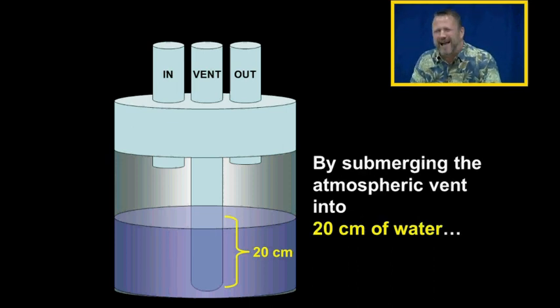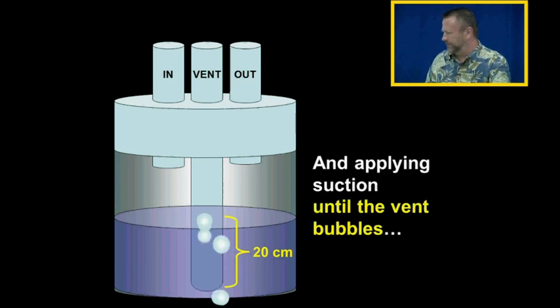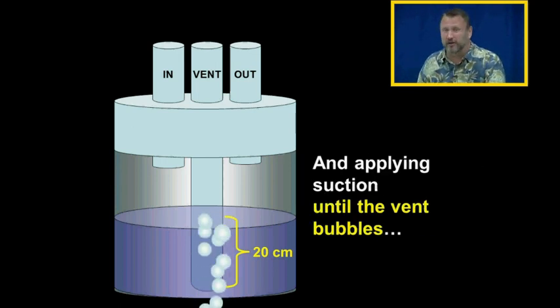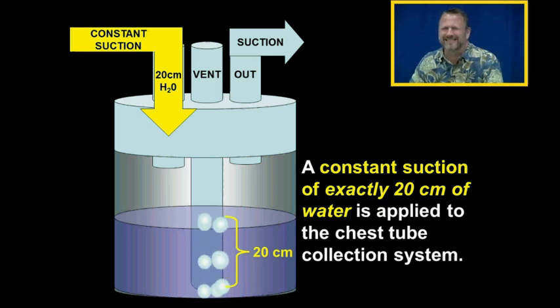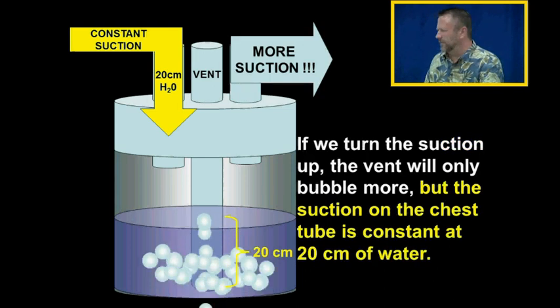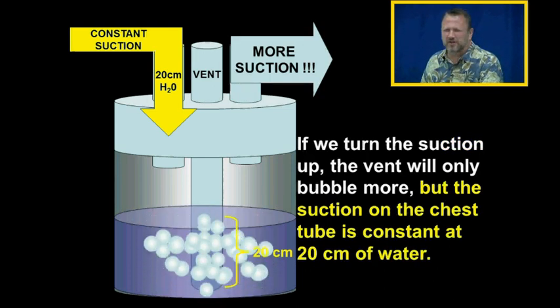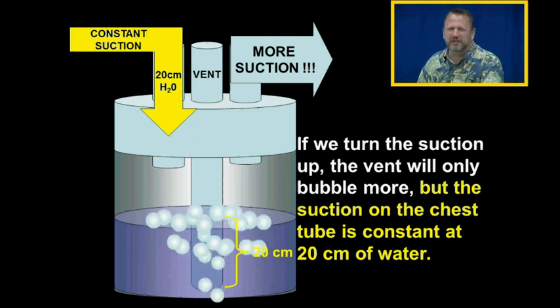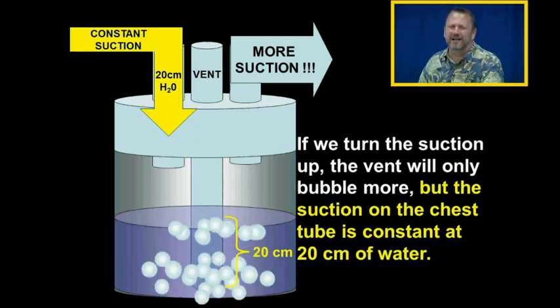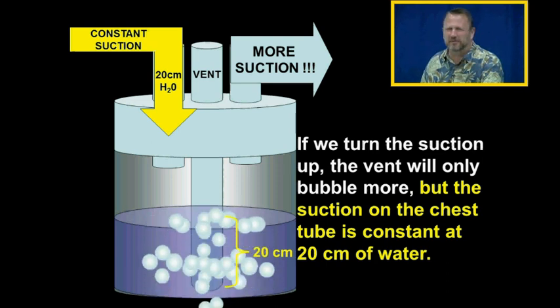By submerging the atmospheric vent into 20 centimeters of water and applying suction until the vent bubbles, then we're assured a constant suction of exactly 20 centimeters of water is applied to the chest tube collection system. So if we turn the suction device up more, the vent will only bubble, but the suction on the chest tube will remain constant at 20 centimeters of water.